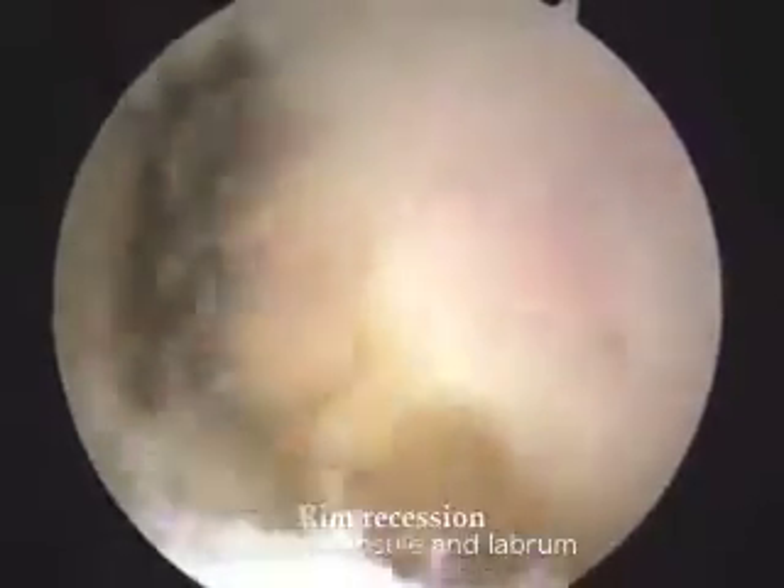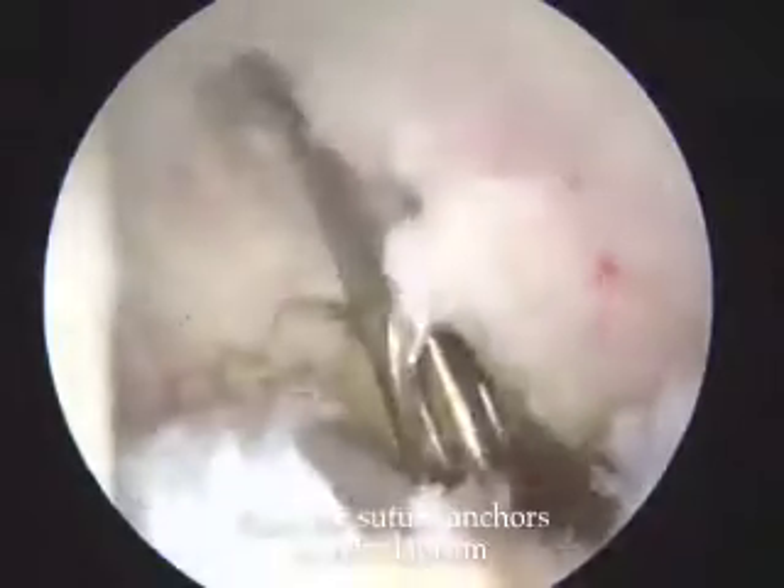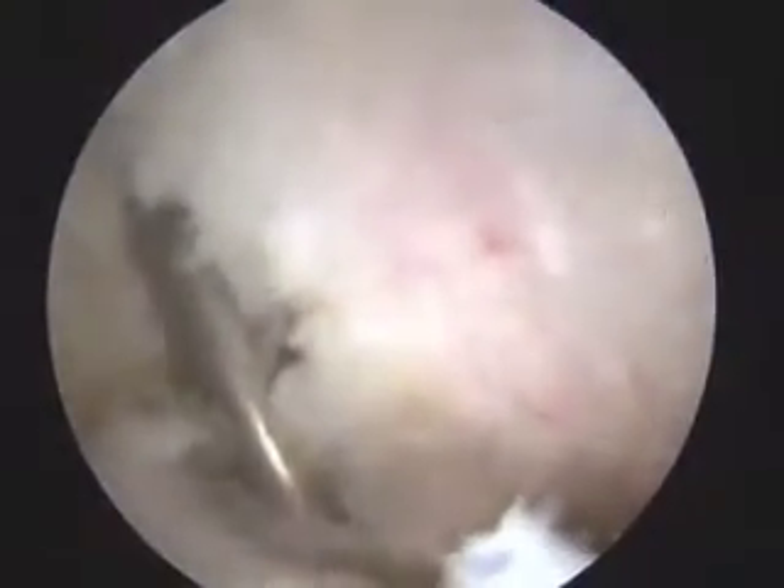We exposed the rim with rim recession and refreshed the rim between the labrum and capsule without rim trimming. We then performed labrum refixation without suture anchors.